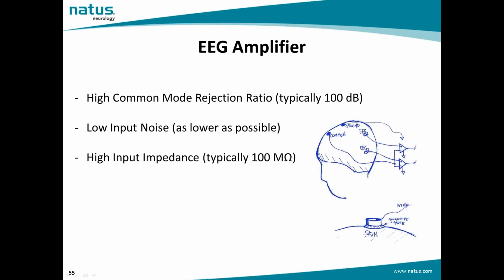However, the signal processing uses information coming from a recorded signal, so firstly we should mainly focus on the quality of the EEG recording. In this case, the EEG amplifier and, as a next step, other parts belonging to the EEG system like the EEG supplies should be taken into consideration, because all these parts as well as the patient preparation play an important role in the quality of the EEG recordings.